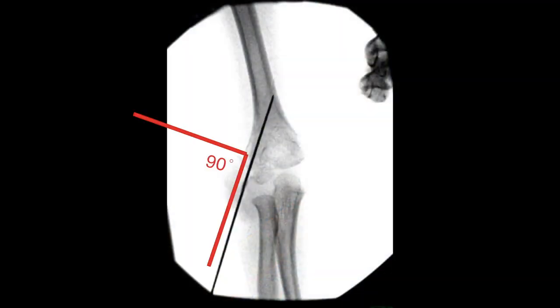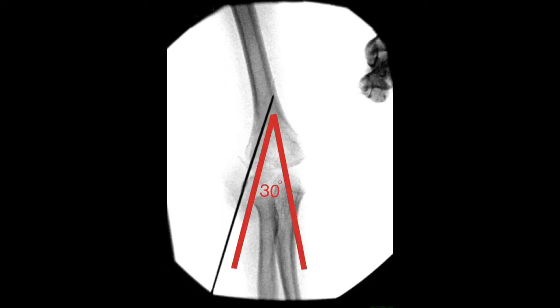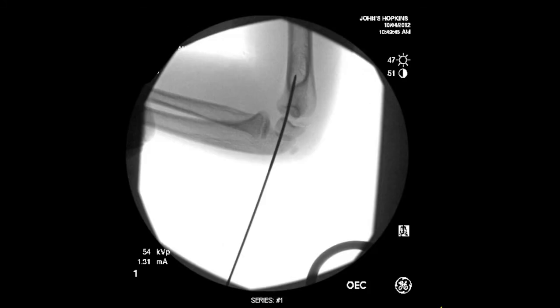The angle of the pin is perpendicular to the fracture surface and avoids the distal humeral fossa. It's approximately 30 degrees to the long axis of the humerus on the anterior posterior view, and 10 degrees to the long axis on the lateral view.